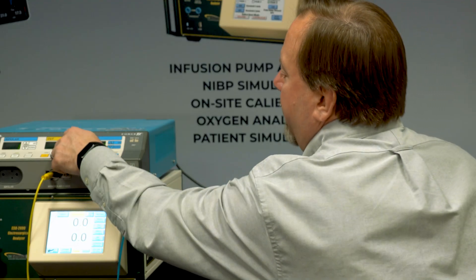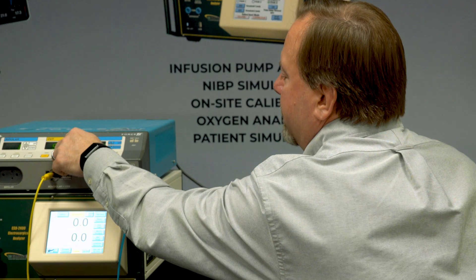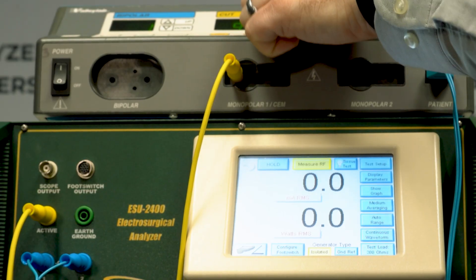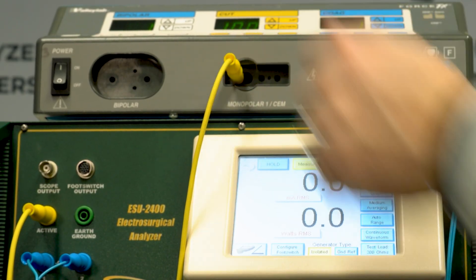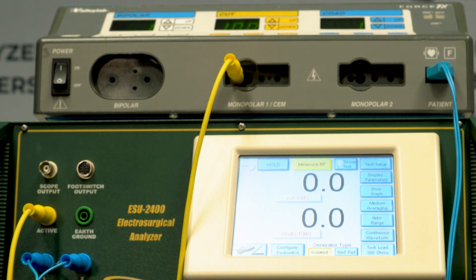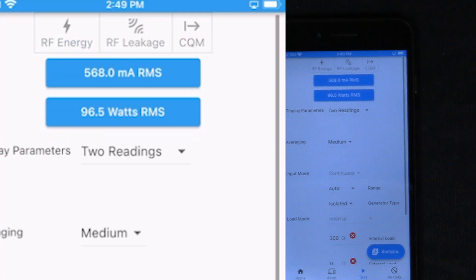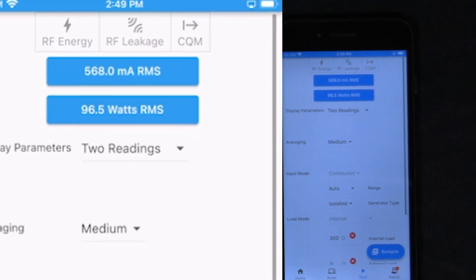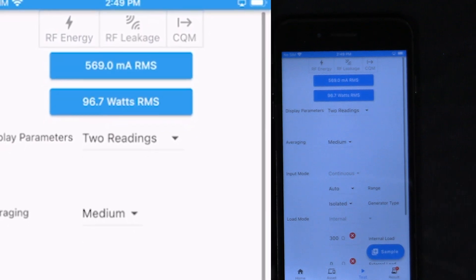We can go ahead and configure the generator for whatever power level we want to test. We can set that on the generator and then activate the output with the foot switch simulator. We'll see the readings on the ESU 2400 and these will also show on MyBC Mobile. I can press the sample button and it will record that reading for me.